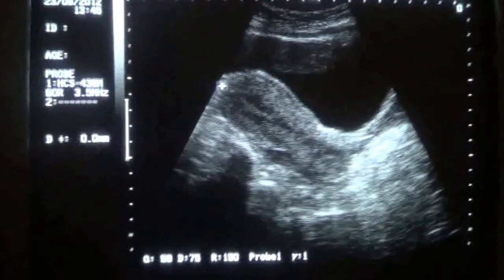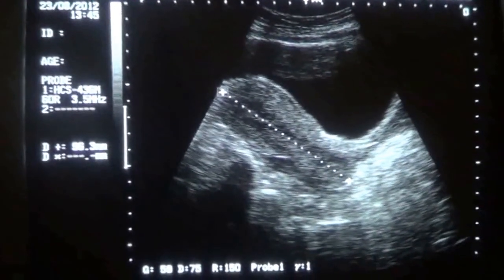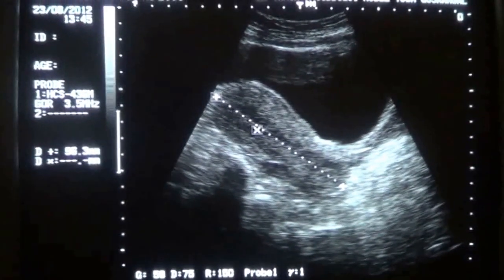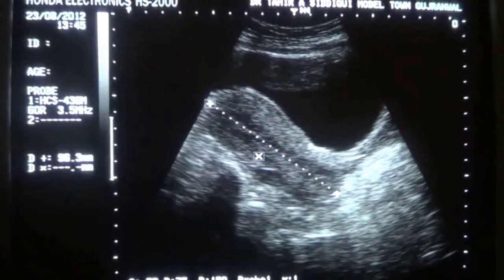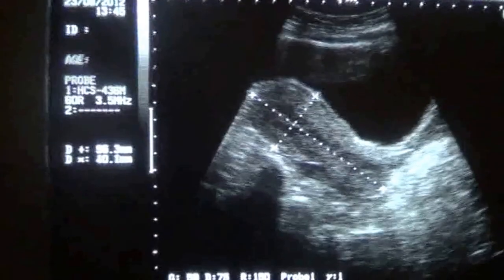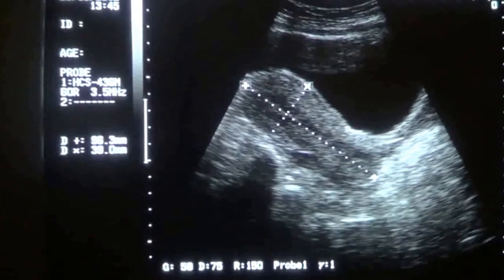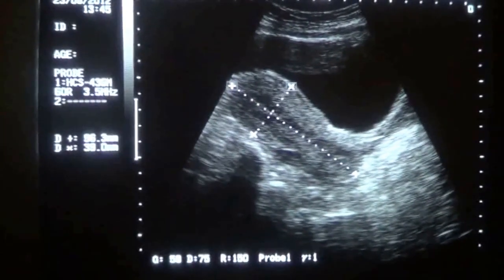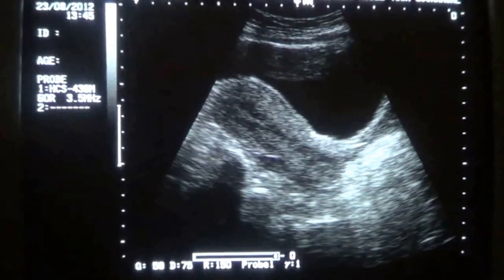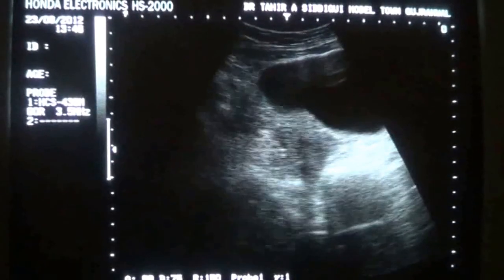It measures 9.6 millimeters, so you can even guess which phase of the menstrual cycle the female is in. Because it's a parous uterus, it measures 9.6 centimeters in length and 3.9 centimeters in anteroposterior diameter. No focal lesion is seen. Normal dimensions are up to 11 centimeters and 5 centimeters.